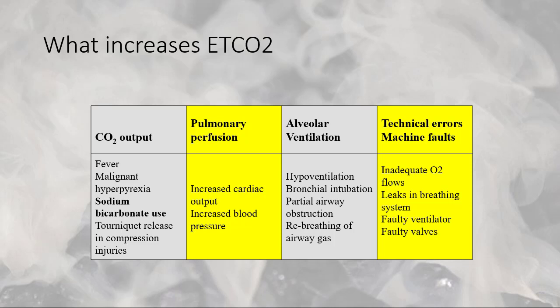in the alveolar space. Then we intubate them and we put end-tidal CO2 on it, and it's through the roof. The highest I've personally seen has been 117. A few months ago, we had another medic on an opioid overdose have 121, something like that. Now, here's the thing: if it was just buildup of end-tidal CO2 in the alveolar space, a few breaths would wash that out.